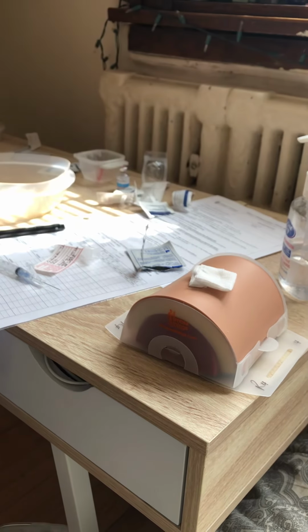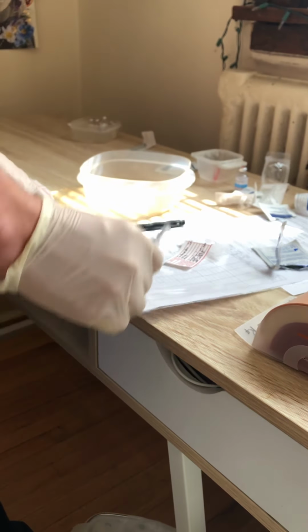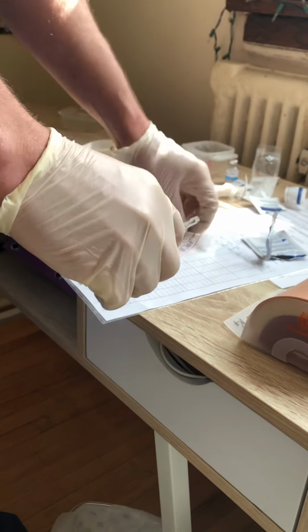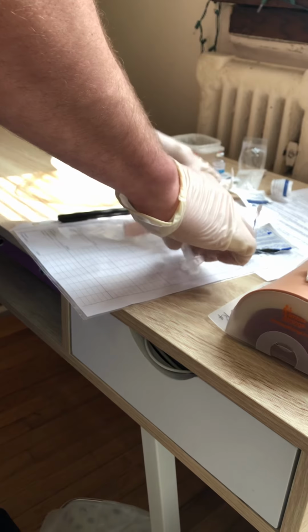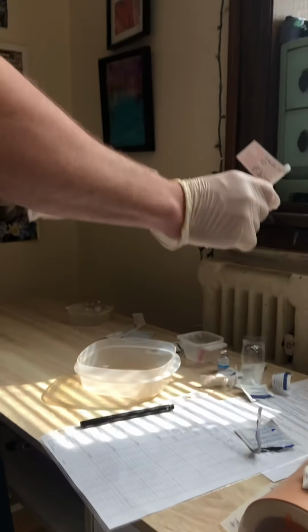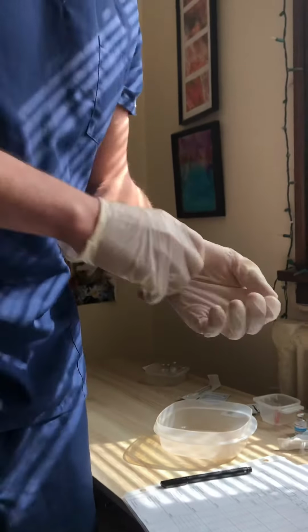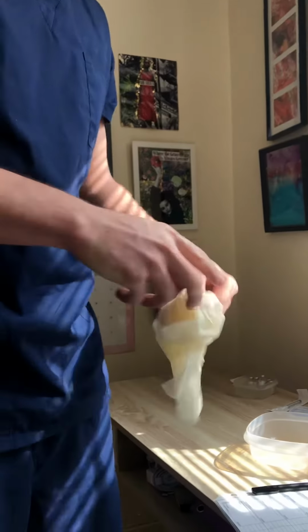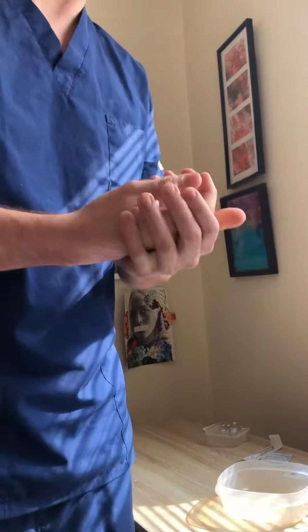So patient will apply the pressure. I would cap my needle immediately while using the safety. For this purpose, I am not going to, as I need to use this needle for practice purposes. But I would dispose of it into the sharps container. So now I would remove my gloves. I would put those into the garbage can. I'd perform hand hygiene.